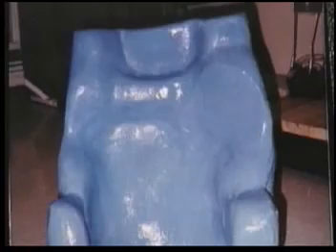Depending upon the temperature and humidity, the insert will take 12 to 24 hours to dry. Siliconing will have to be done in stages to cover the entire insert. Cover as much as possible with each stage. When the insert is dry, turn it over and silicone another portion. Foam-in-place inserts finished in this manner are flexible, durable, and easily cleaned.